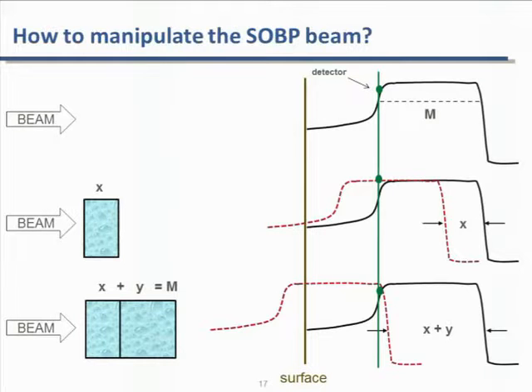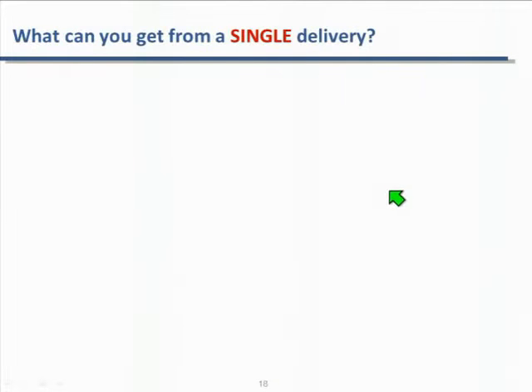But now we understand that we can do this. The reason we're trying to do this is that beam time is precious in proton therapy, so you have to design your setup so that you can QA as much of the beam characteristics as possible with the least amount of beams. So we have to be smart about how we design our QA devices so that with a single beam delivery we can check for several of those characteristics.